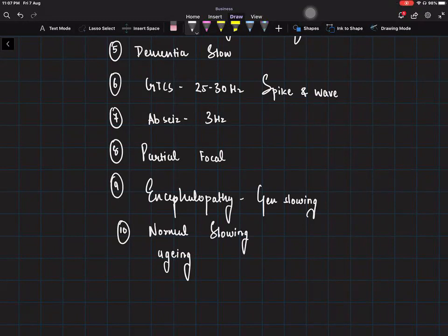If you've read any EEGs, you would see that even in a clear-cut GTCS EEG, they will make sure that they're on the safer side, and they'll write for themselves to kindly correlate clinically, wouldn't they? Yes, sir. So these are just broad findings that you would have.